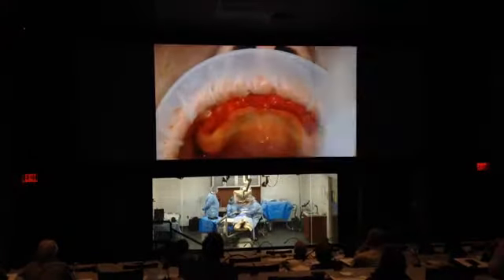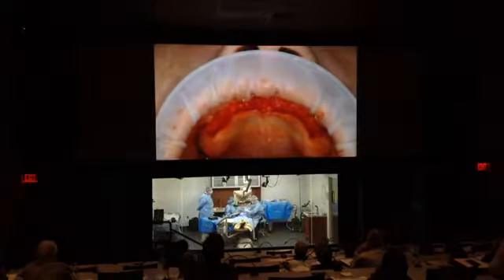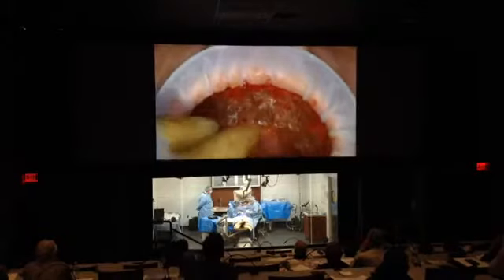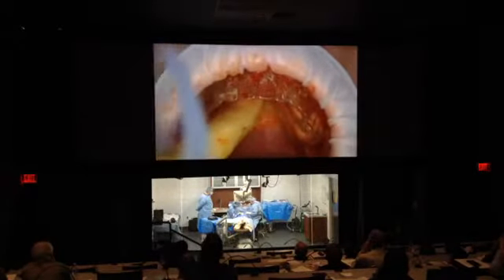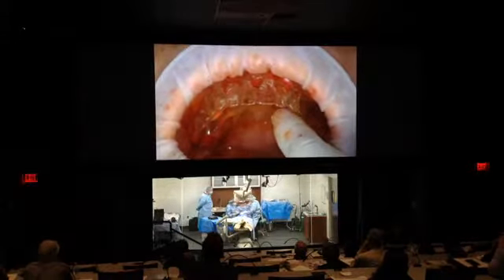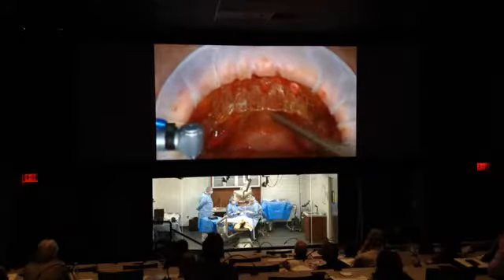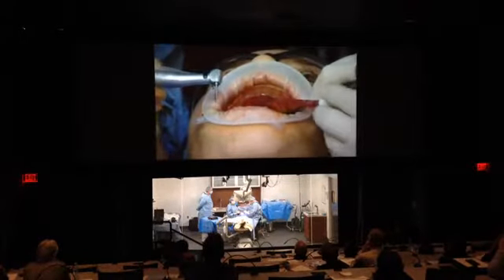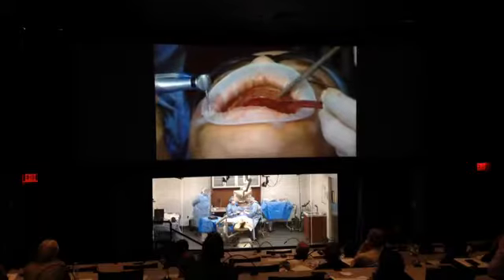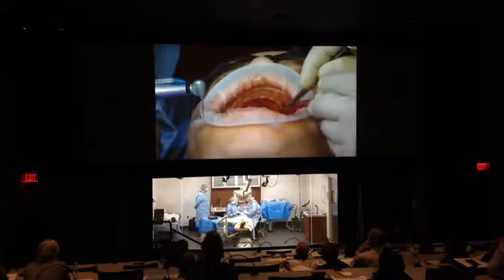Very good. So we're going to use the surgical guide. I'm going to mark a little bit the entrance. Go ahead and hold this guide for me. The first drill I like to use is a precision drill. The reason why I like it is because it has a sharp point at the end, and it allows me to secure it on the ridge itself, so it doesn't skip around. Usually round burrs can skip, or if you go straight to the 2 millimeter twist drill, it would certainly skip around on the surface area, especially since the bone is not fully regular on that side.